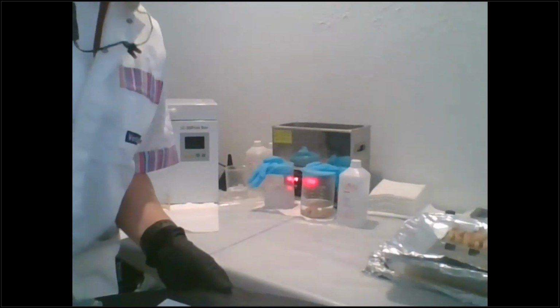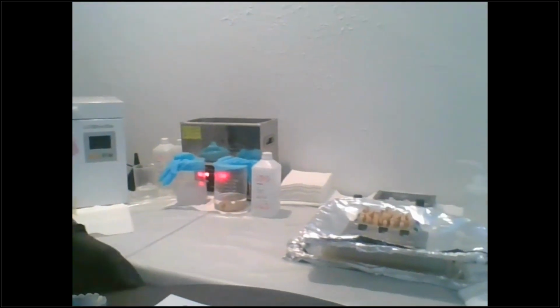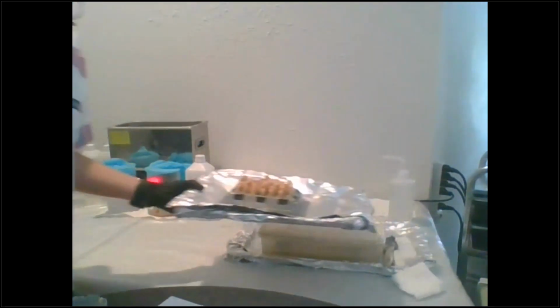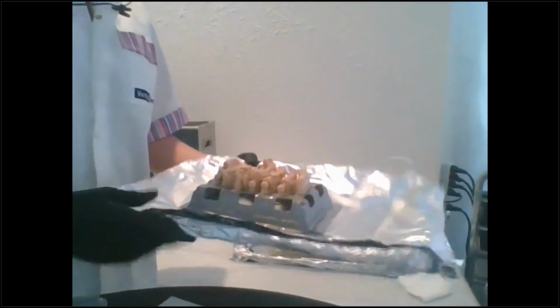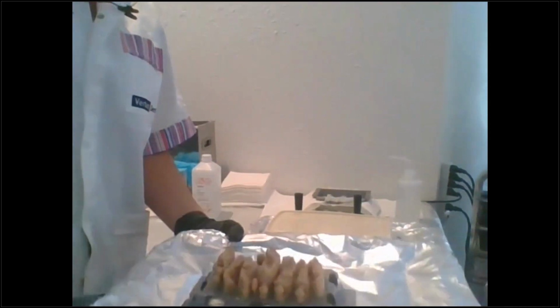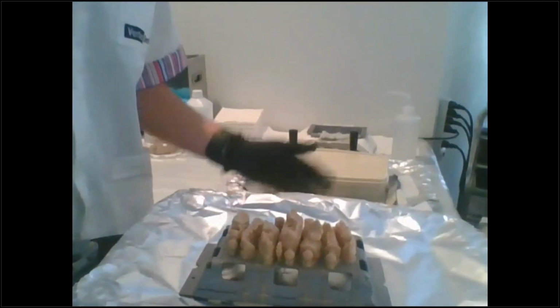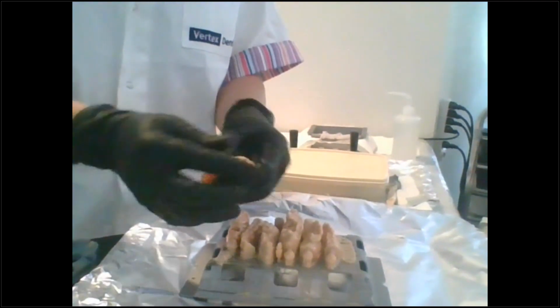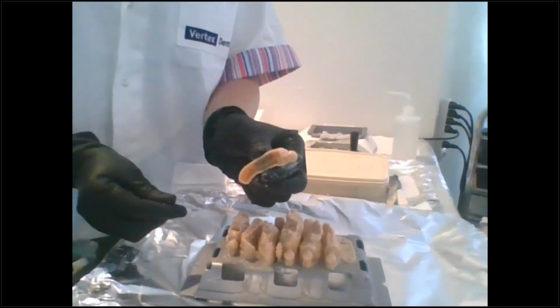And I'm going to show you how I have this set up. Now, you can see my models here. Now, what you're going to do when you remove your models from your build platform is you don't need to punch them out, okay? You just need to twist them off and rub off your supports. Now, I have no supports, okay?